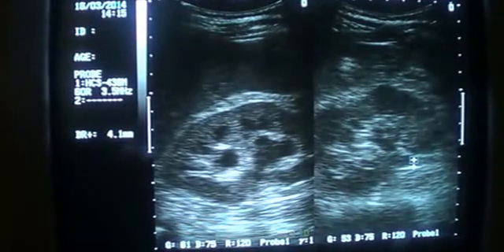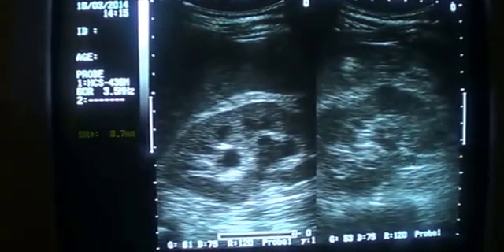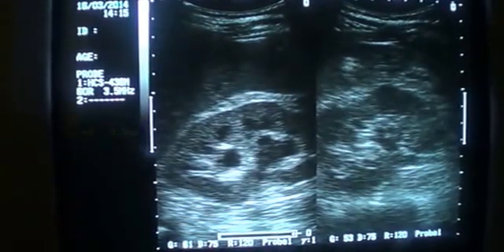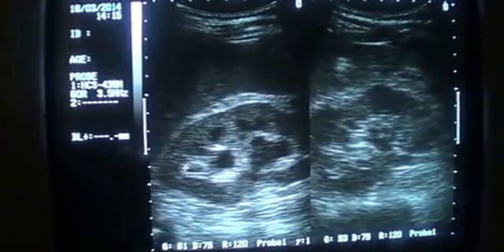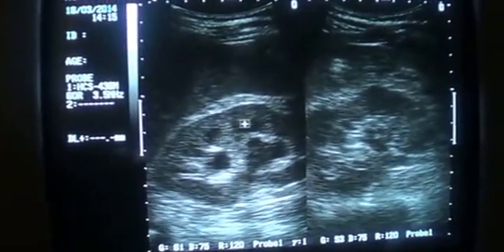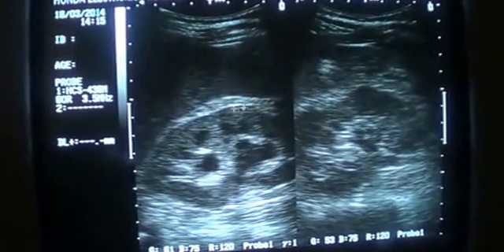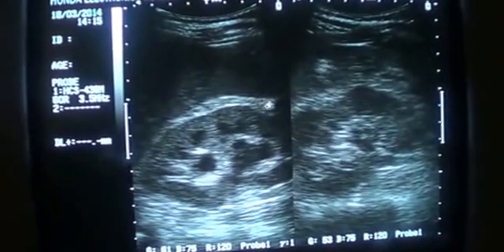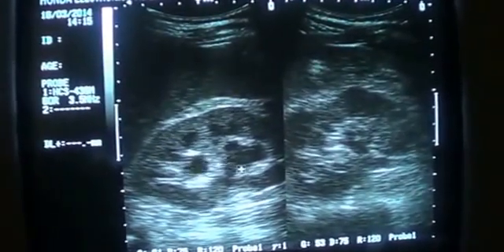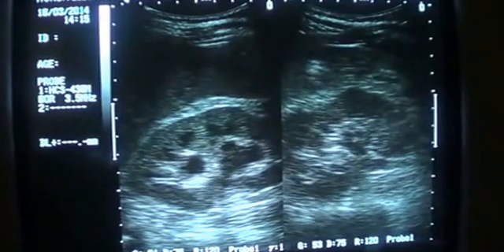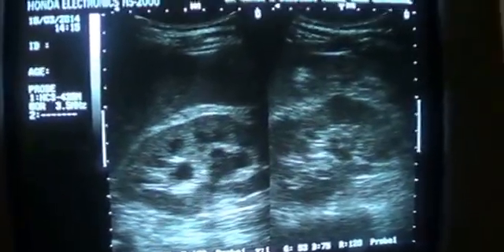Now these black tiny cystic areas — 1, 2, 3, 4, 5 — these are the pyramids, and this is the cortex, this is medulla. These are the dilated calices.